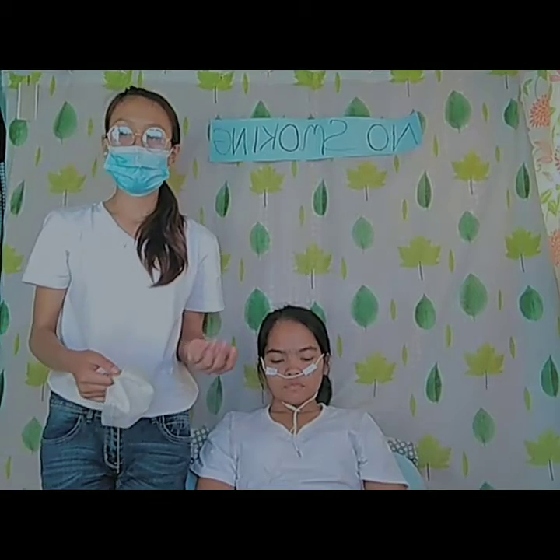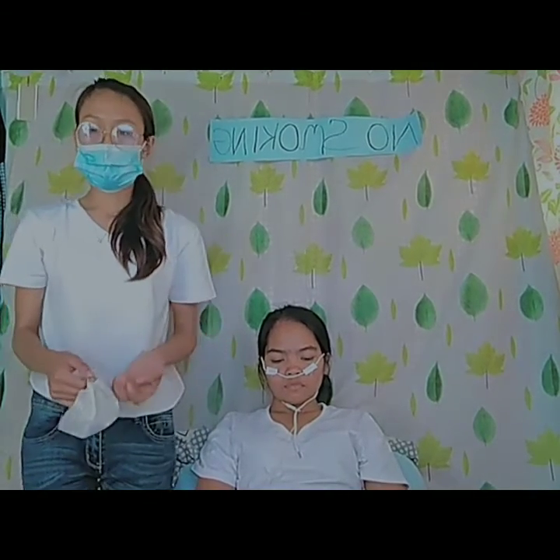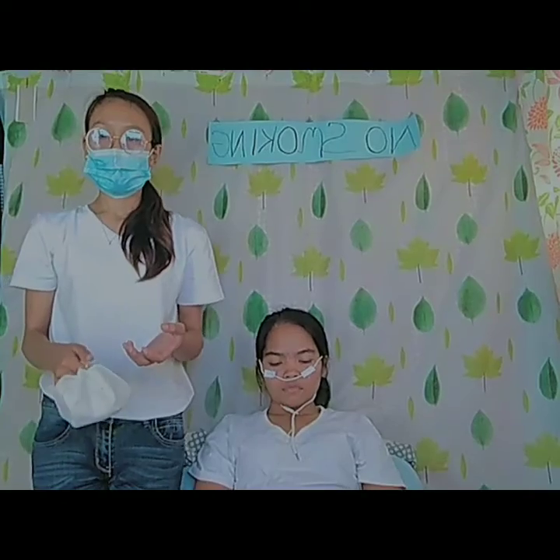When using a mask for oxygen for the patient, first we're going to place the mask on the face of the patient, applying it from the nose and over the chin. Then we're going to adjust the metal strip over the nose and contour the mask to the face. Then after that, we're going to adjust the elastic band around the head so the mask fits snugly to the patient.